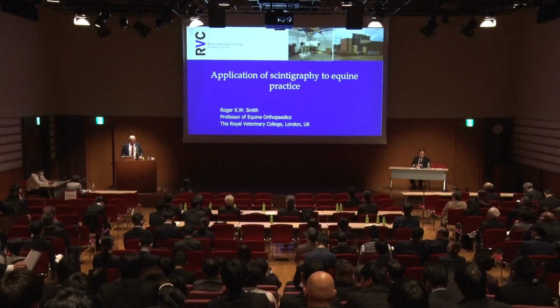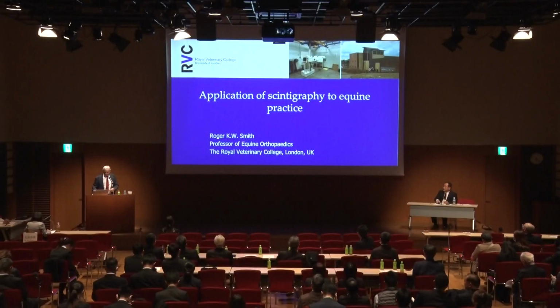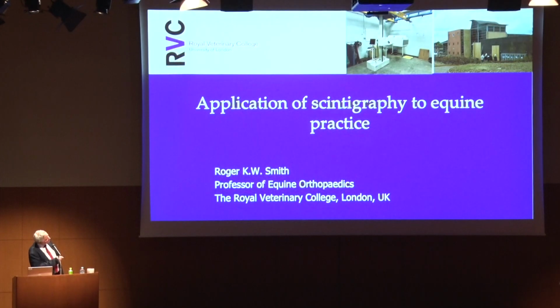Okay, thank you. So we now turn our attention to scintigraphy and how that can be applied to our investigation of orthopedic disease. And this is our hospital at the RVC, and this is our gamma scintigraphy room.